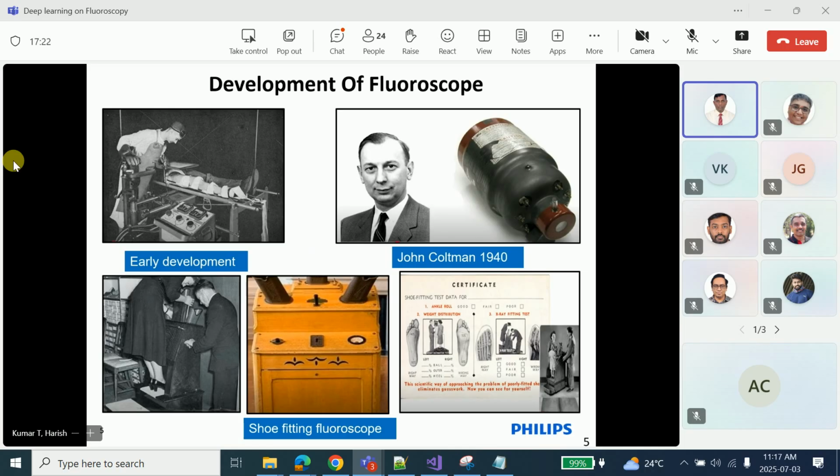And this image shows the advancement in the fluoroscopic discovery: if you see, the tube and the detector are coupled to each other. That's the first time that they were together. They were not elsewhere, they were together. So this was there, but the adaptation to the dark room continued. So still they had to go to the dark room, wear the goggles, and see it on the fluorescent screen. This is what was happening.